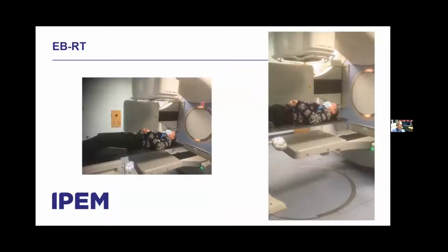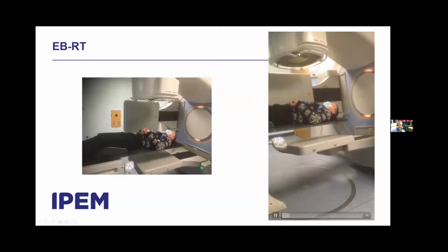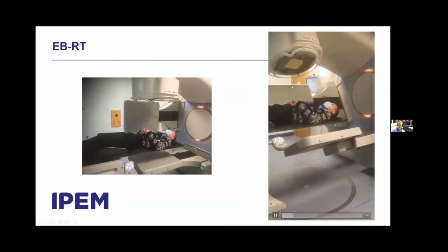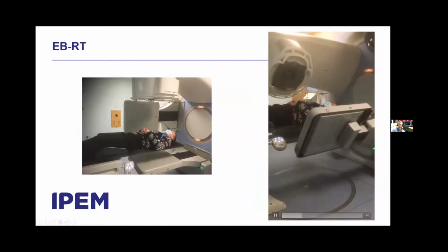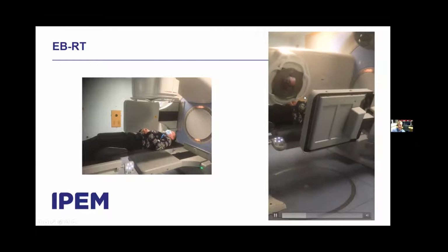So for those of you that don't like simulations, I thought I might just set myself up on a treatment couch, just to sort of ram home the point that this is not all in silico. This does actually really happen. So this is me on one of the Elekta machines here at CUH. And I've got a short video showing you the various components of the LINAC and how they revolve around the patient in order to deliver the X-rays. So again, the radiation comes out of the treatment head aperture. These are the imaging arms. And as you can see, the whole assembly rotates about the patient delivering the dose.